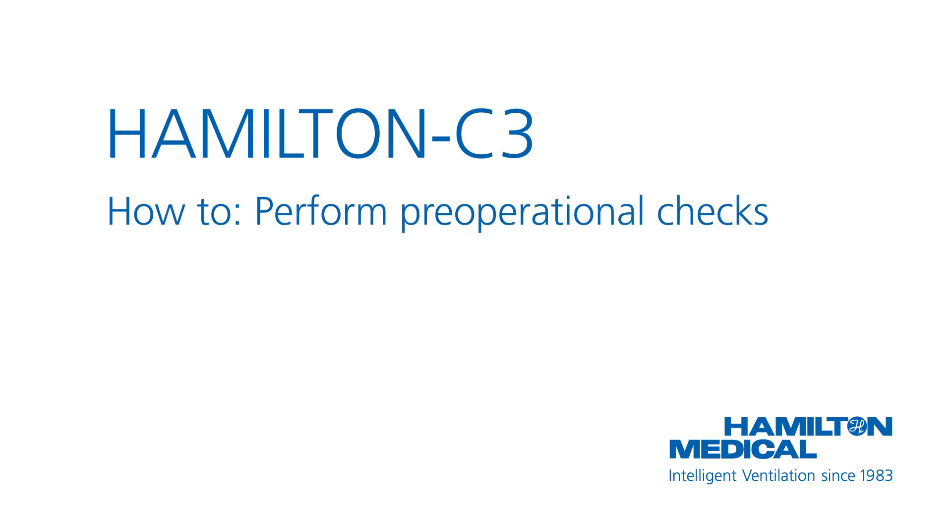This how-to video will show you how to perform the pre-operational checks, including calibration of the flow sensor and a breathing circuit tightness test. You will also learn how to perform calibration of the O2 sensor and zero calibration of the CO2 sensor.